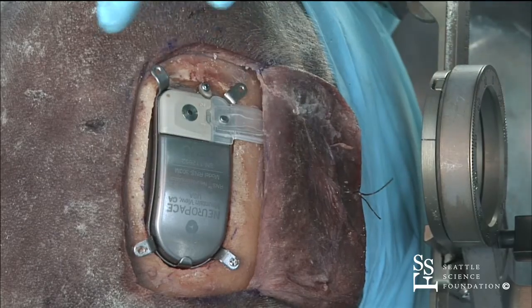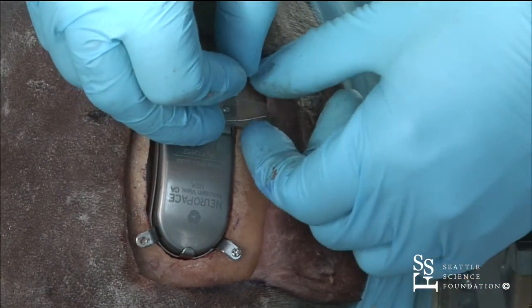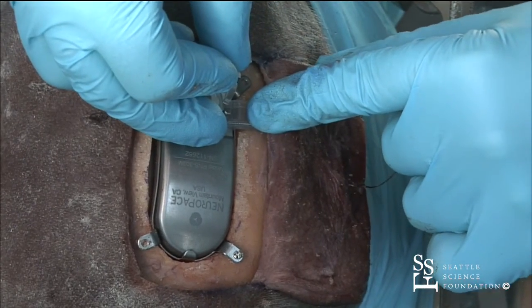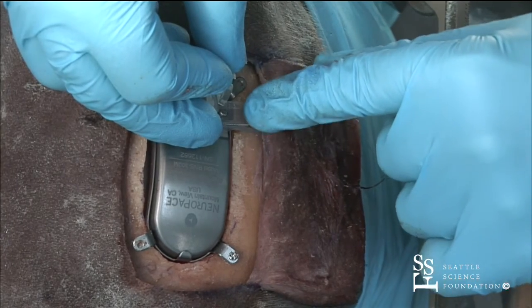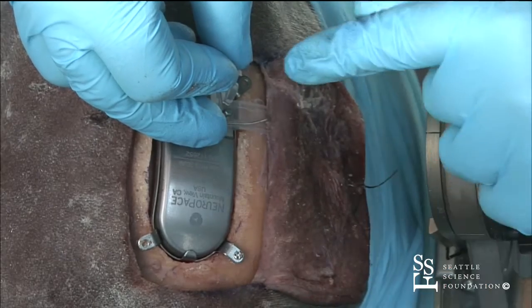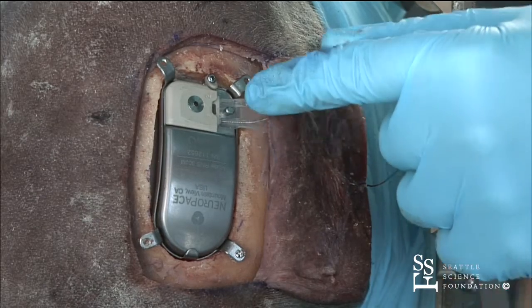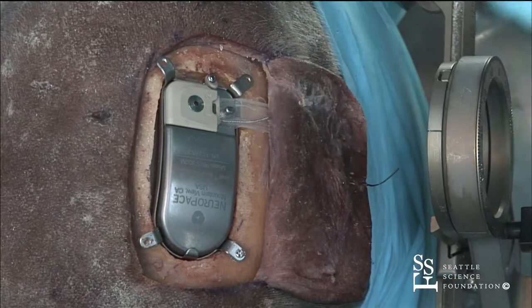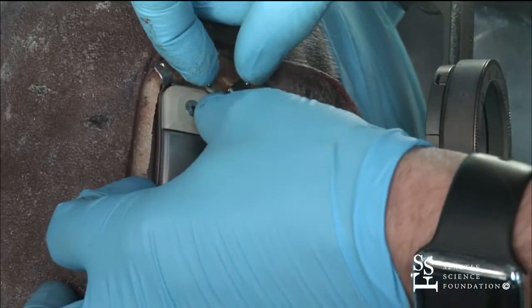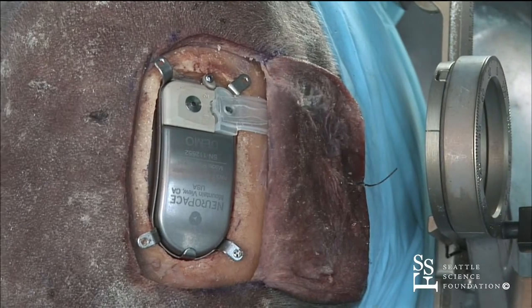And typically, I didn't show it, but we often will take a little bit of bone out right here, because with this strain relief, if you don't feather the bone on this edge, the strain relief will stick up more and try to poke out through the skin. So I'll typically take a 4mm round and just feather the edge of the bone right here, so there's a more gentle transition over the skull space. And once that's on, then we basically close up.